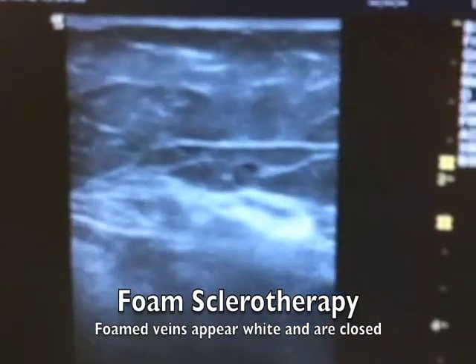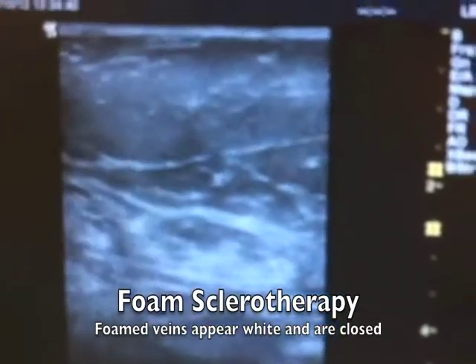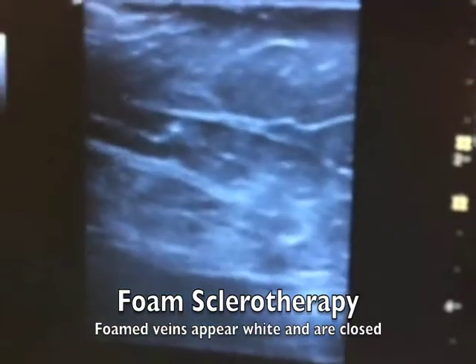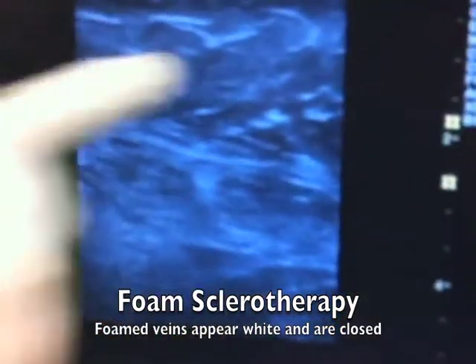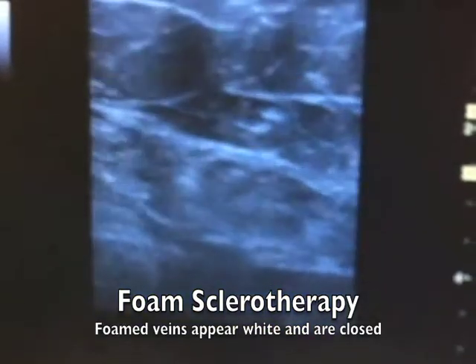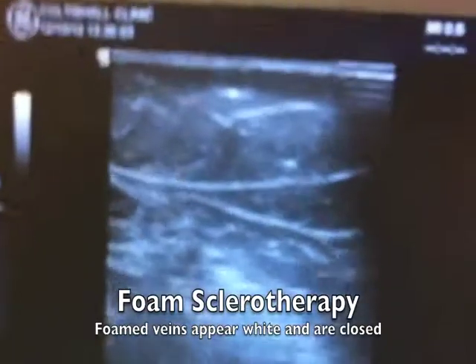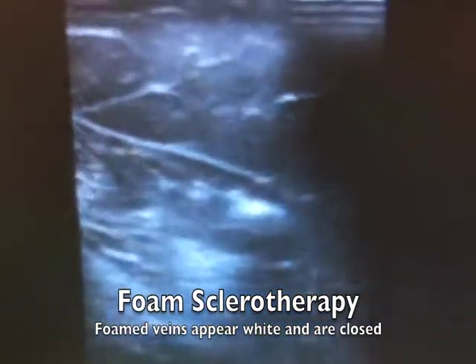You can see the shadowing from the foam there, and then it goes up into the main vein. See all that foam there going into the varicose veins up top. See the veins and all that — it's like drifting into the horizon.